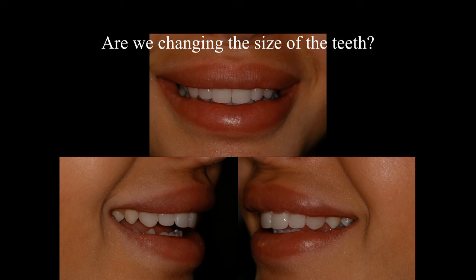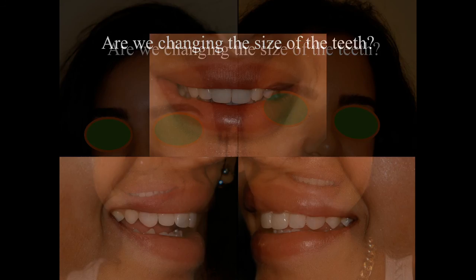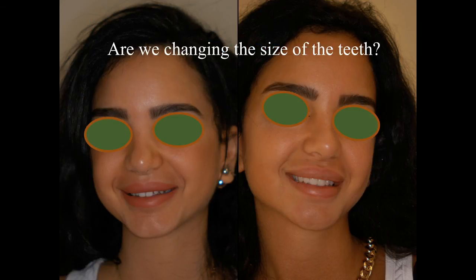The patient had been advised to also cover the first premolars, but she had refused. That's why you can see the extended size of the canines distally more than it should have been. But for the patient, this is the frontal view that we could do. We could not have longer incisors, because the longer incisor will impinge on the lower lip, and the phonetics of the V and the F will be compromised. That was the maximum length that we could obtain with this build-up technique. As you can see, the transformation of the smile of the patient from your left side to the right side.